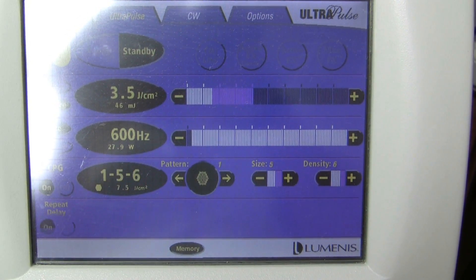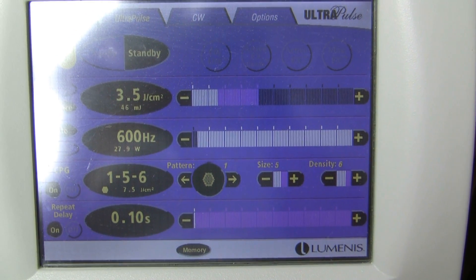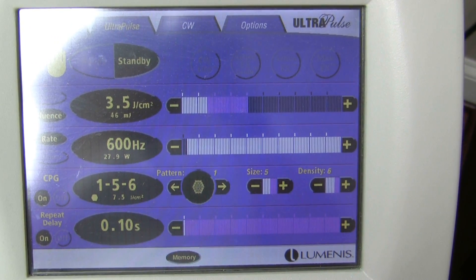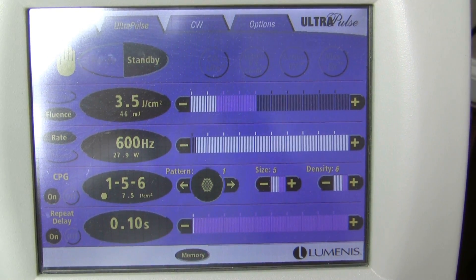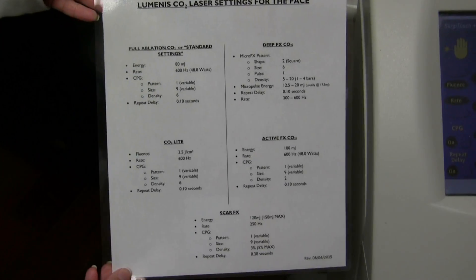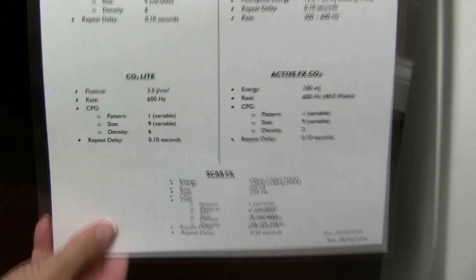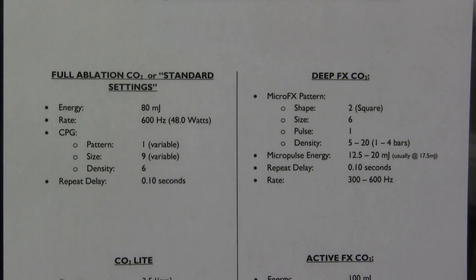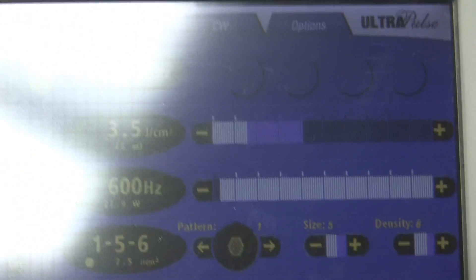Those are the CO2 light settings. If you can't remember what the settings are supposed to be or which memory to use, on the side of the laser there is a laminated paper with magnets. It shows the settings for CO2 light, Active FX, Deep FX standard settings, and at the very bottom the Scar FX settings. That is how to set the laser up.